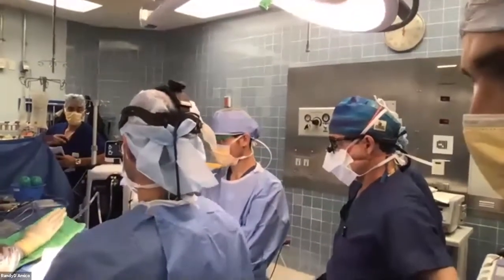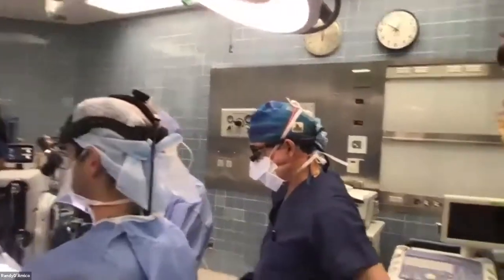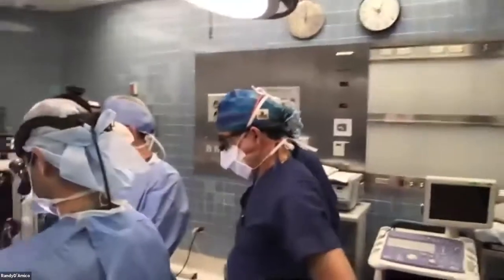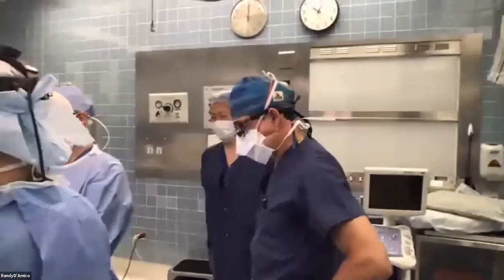Right side, sterility is confirmed. Right side, they're still preparing blood. We'll send for it as soon as it's ready. We have independently and collectively identified the patient by name and birthday without any discrepancies.